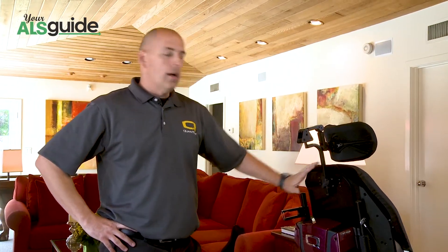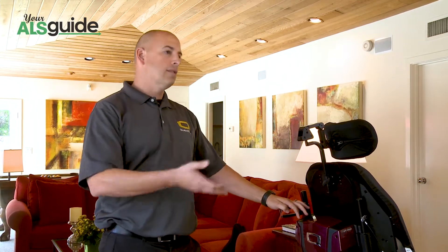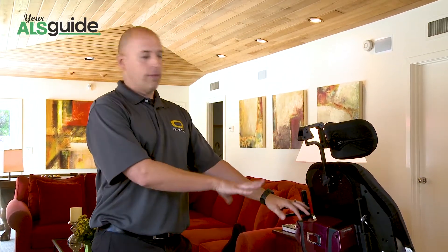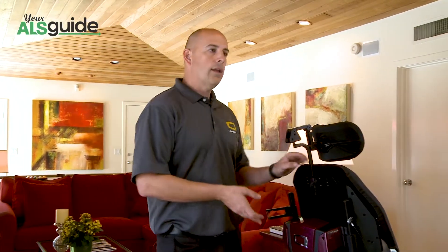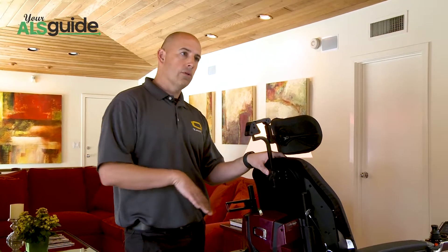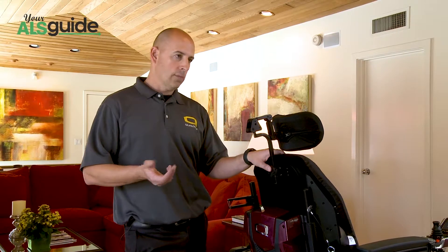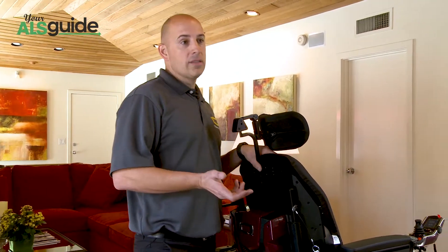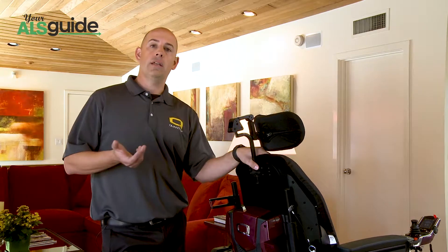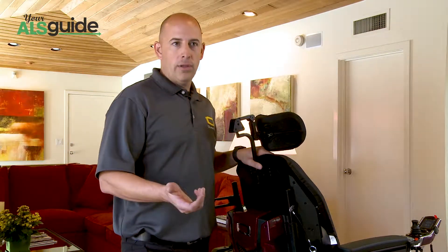Additionally, you can hang whether it be a suction machine, purses, personal items — all off of these hooks so that you can bring it with you. We do have the option of a ventilator power supply that can be ordered with the chair, and it can actually power the vent from the chair's battery with a converter. That is available, but it's not often covered, so if you can get the respiratory company to give you the additional battery in the bag, it's typically the way to go.